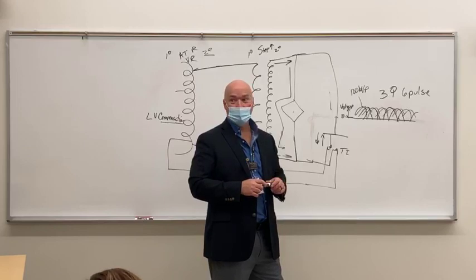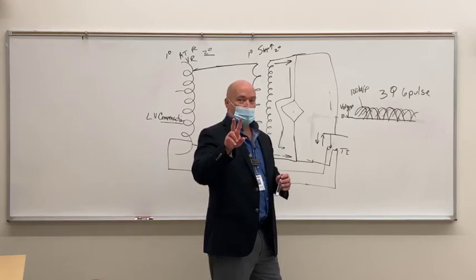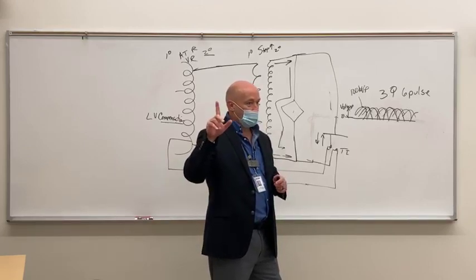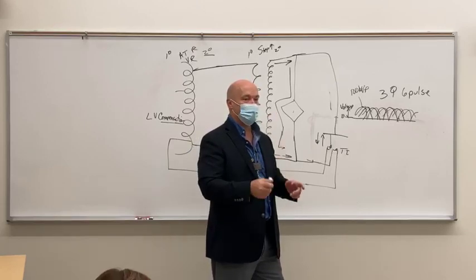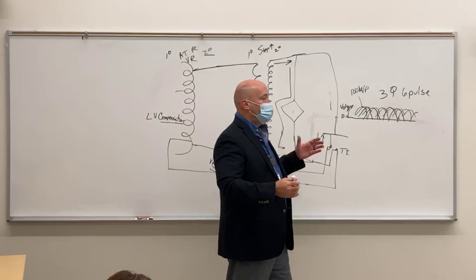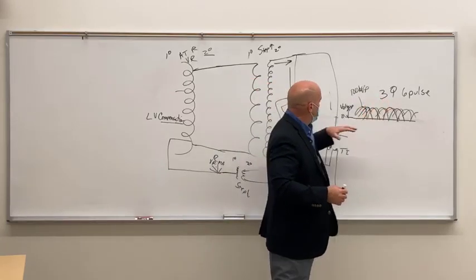It's been a long semester. He did 2 things. One was beam limitation, collimation. What was the other one? Filtration. Bingo, filtration.